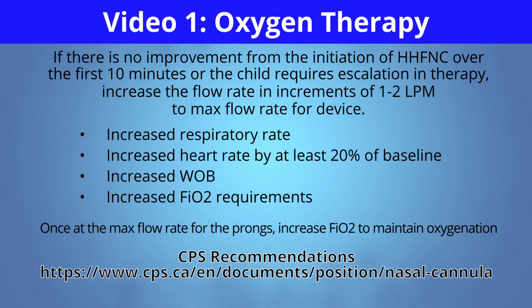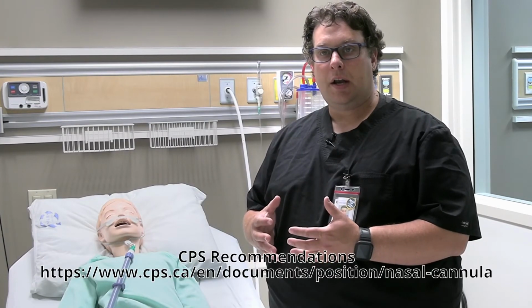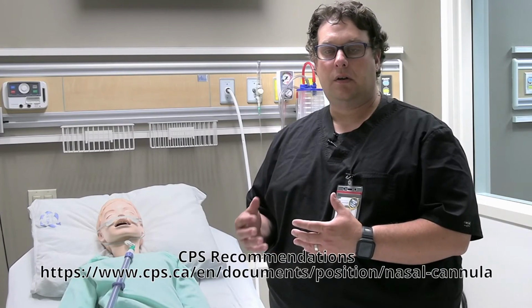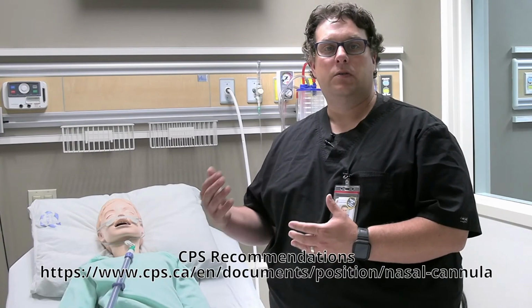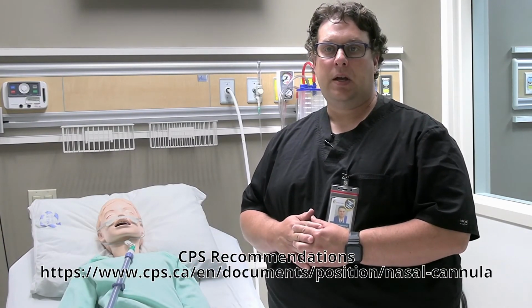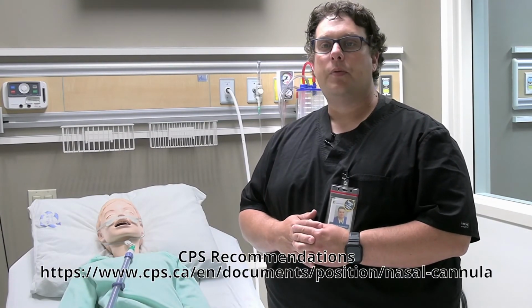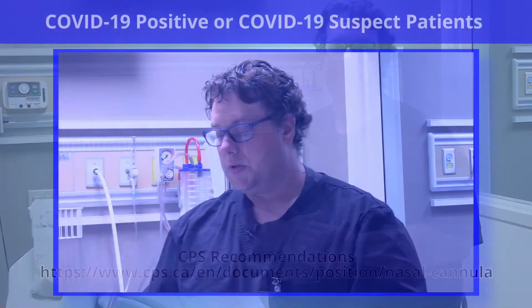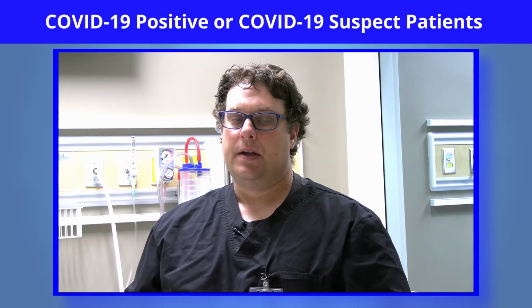Okay. If you have a patient who is still not improving on high flow, then you need to start thinking about other alternative modes of therapy. The next logical step would be moving on to non-invasive mechanical ventilation for this type of patient. But also keep in mind that this patient may begin to tire out, and may ultimately need to be intubated and provided mechanical ventilation.